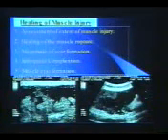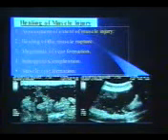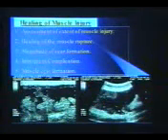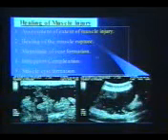Then coming to the injury, there is a process after that injury. The body starts the healing of the injury, and ultrasound is very helpful in evaluating the healing process. The process starts with the hematoma formation, organization of the hematoma, resolution of the hematoma, then of course the fibrosis and how much of it has taken place. Clinically you cannot evaluate that, and you can evaluate it only by ultrasound. Healing of the muscle rupture and the magnitude of the scar formation can be seen with ultrasound.